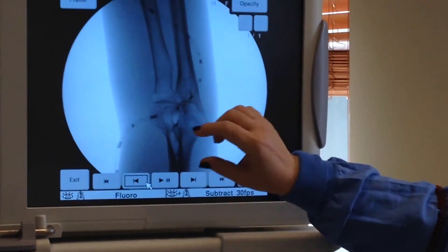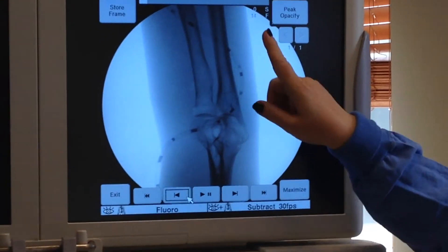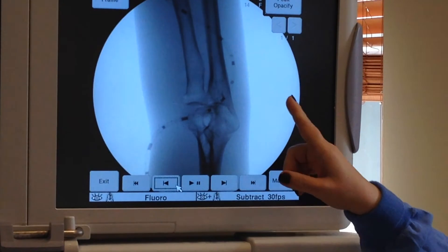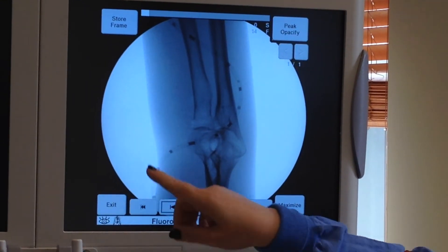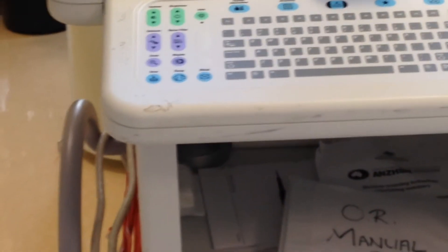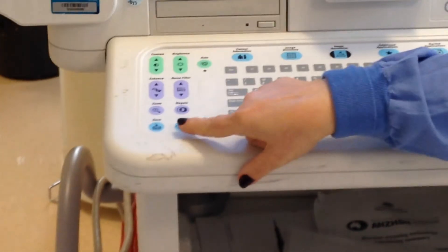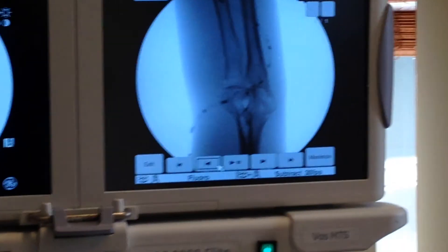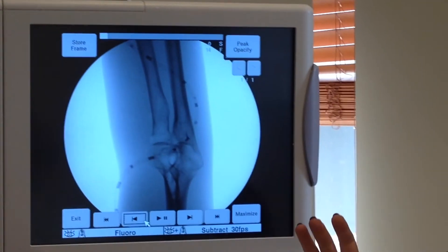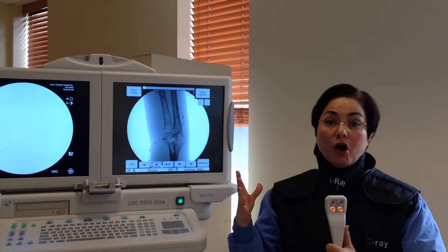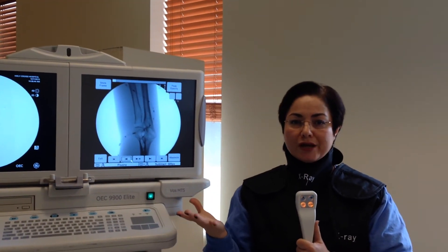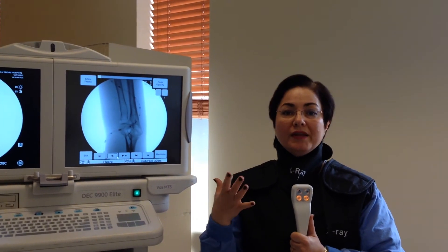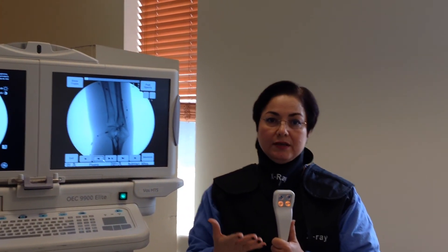After you get to the point where the doctor can see the frame he wants, you are going to save it using the save button. Because you don't need to save and send all the frames of subtraction or road mapping — just save the one the doctor wanted to see.